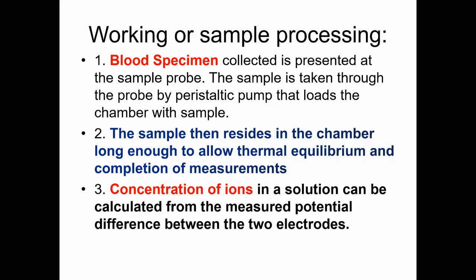After keeping it in the machine, what happens? When the blood sample is kept in the machine, the probe will come and go for insertion.